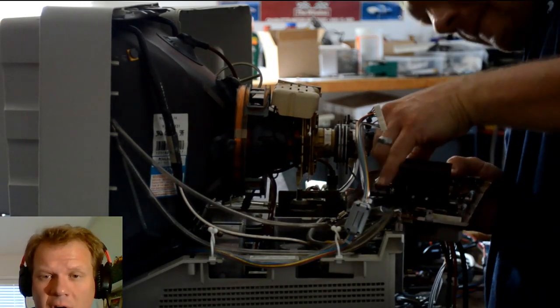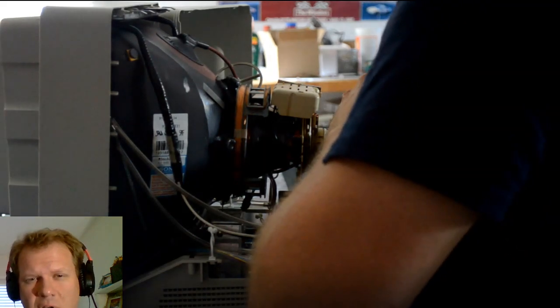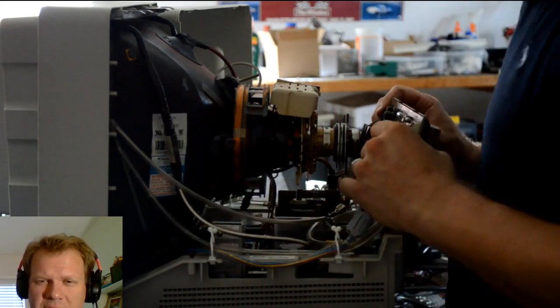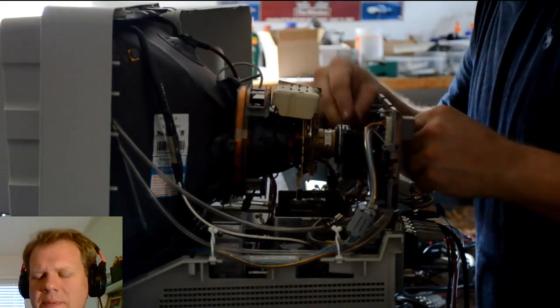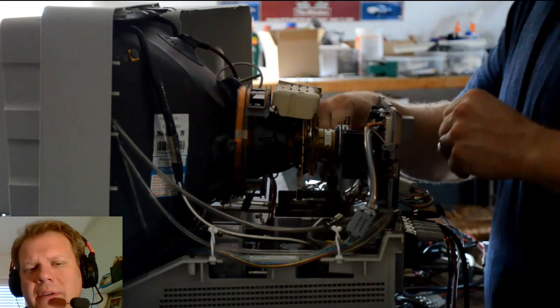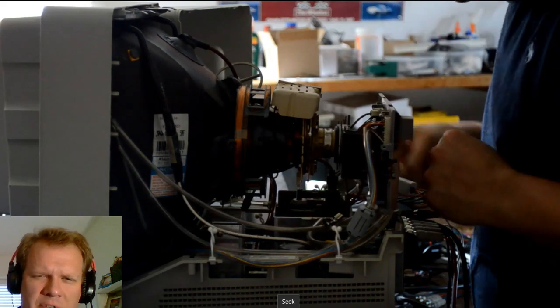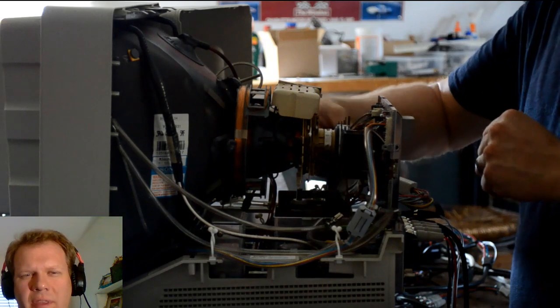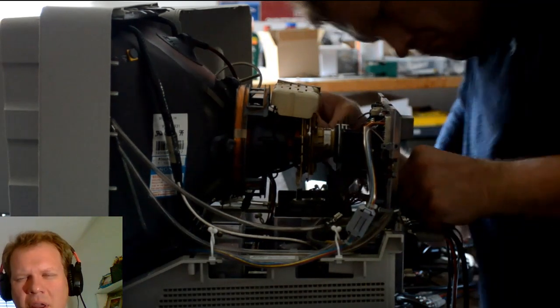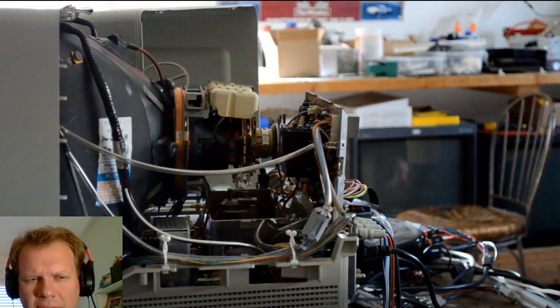Again, this is one of the things that I like to do. If I have an extra part, that's going to save people on repair costs and a lot of time troubleshooting. So the quickest thing here was just to swap this part out with a backup part, and we'll get it all hooked back up in a second and see what the results are on screen. Now, just be careful if you're ever inside here. This is a delicate area since it's right near the electron gun and all the fragile pins around the tube. You definitely don't want to crack that because that'll ruin the tube entirely.